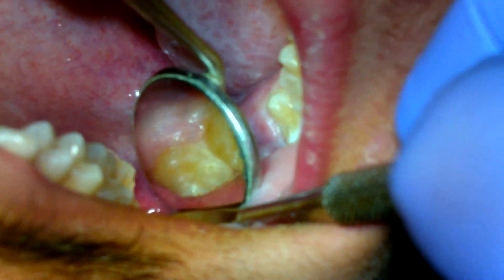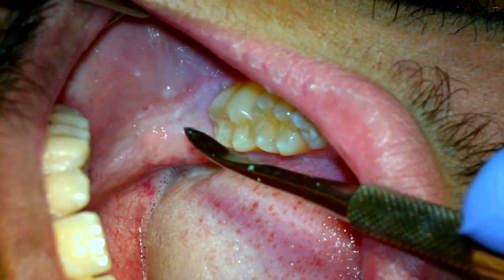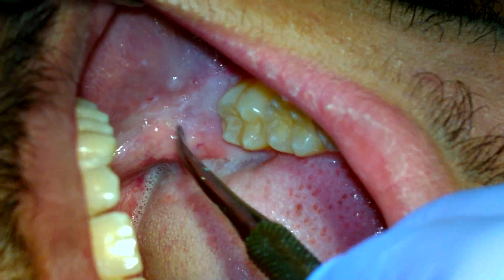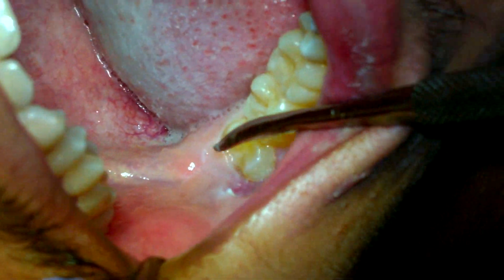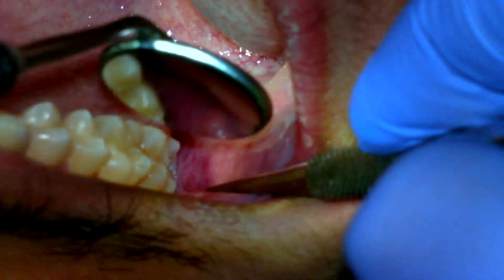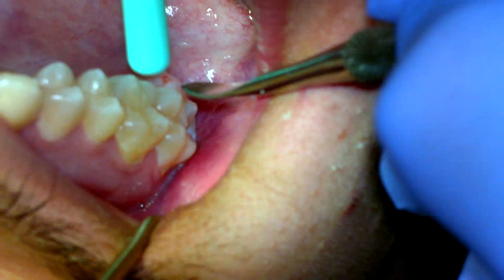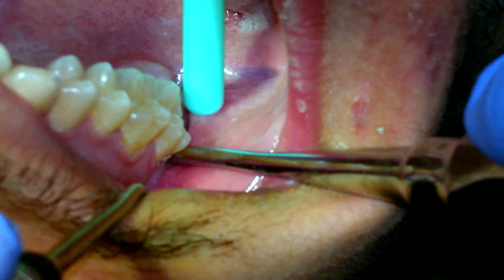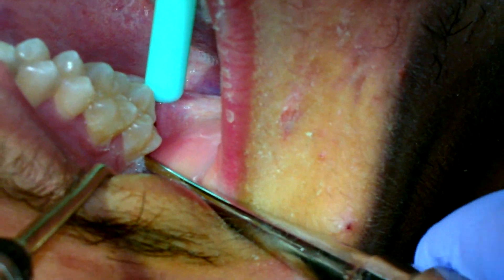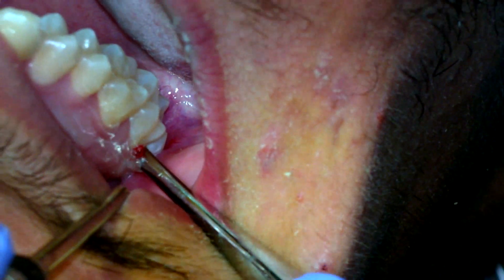We're going to take out number 1, 16 here, 17 which is covered under his gums and his bone, and 32 which is partially impacted. I always start from the top. When I press here, does anything feel sharp? How about here? Good.